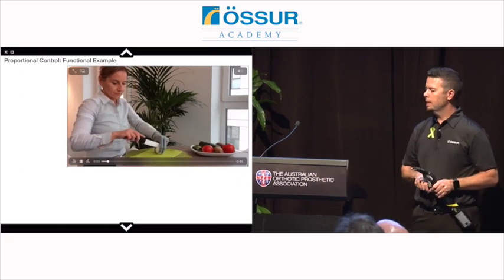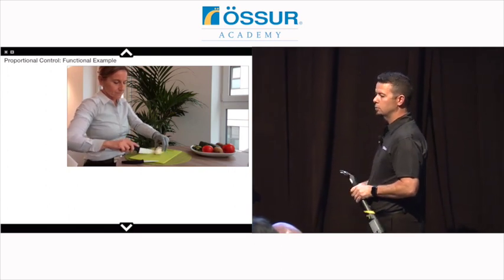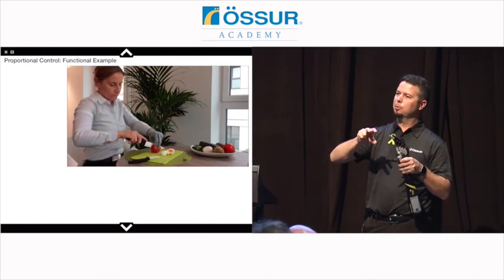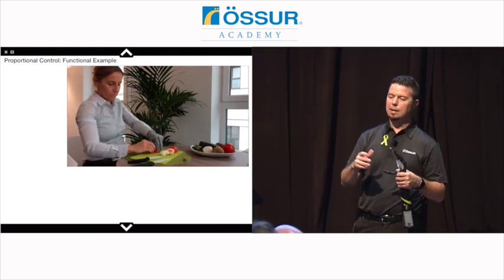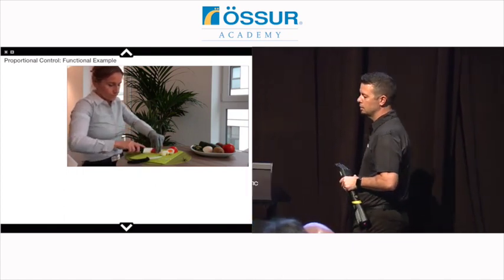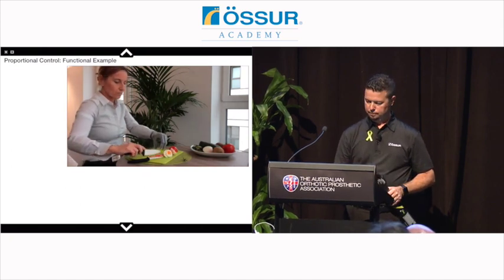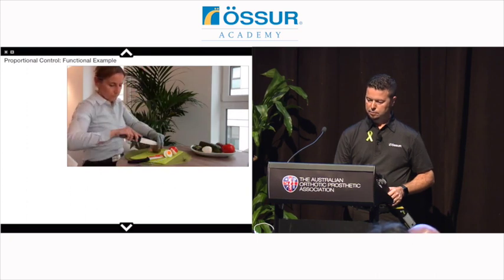A functional example of that is everything from hard-boiled eggs to grape tomatoes, or I've even seen people use the prosthesis to just pull grapes off of the stem. It's a good example where you just need enough force to hold that, but not enough so it slips. And styrofoam cups are another good way to test that out, being able to hold something delicate, how's their control of the force and the speed. She's just going to town on these fruits and veggies here.